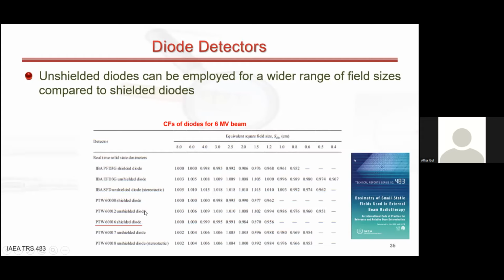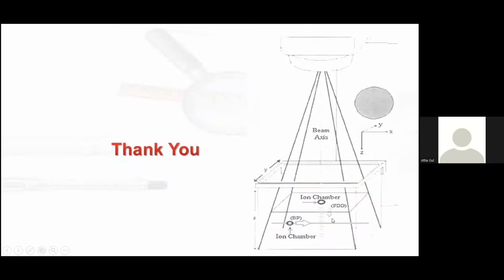procuring unshielded diodes that are inexpensive as compared to plastic scintillators and diamond detectors, and also equally good for small fields. Thank you.